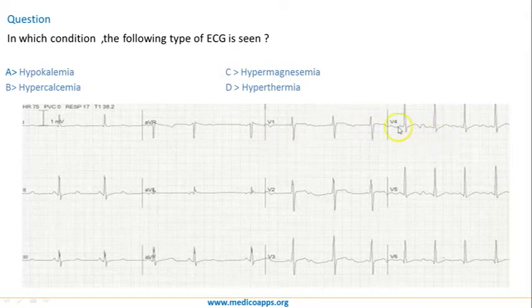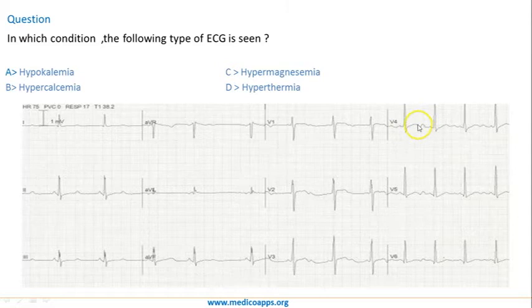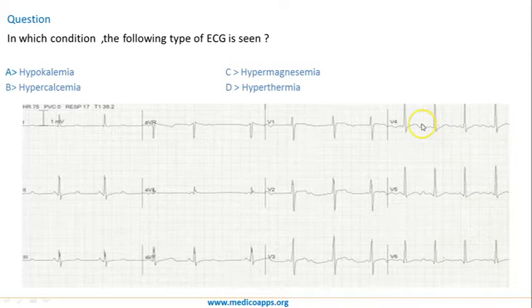You can see in all the leads this is the T wave and this is the U wave. When there is bradycardia, the U waves generally become prominent, which is normal.